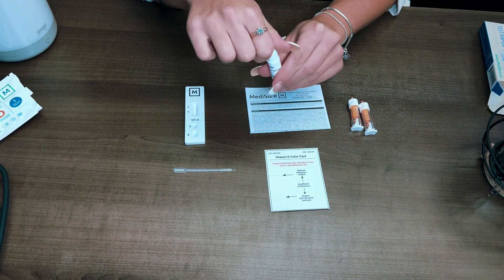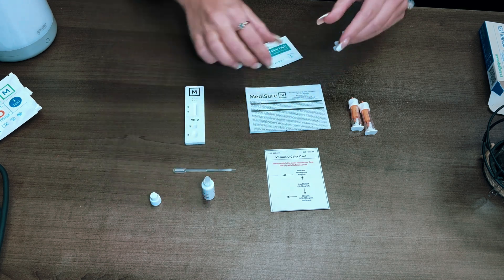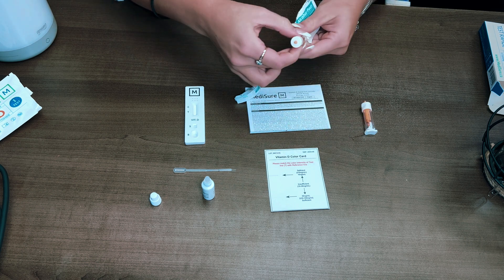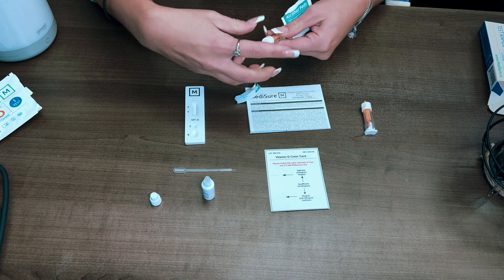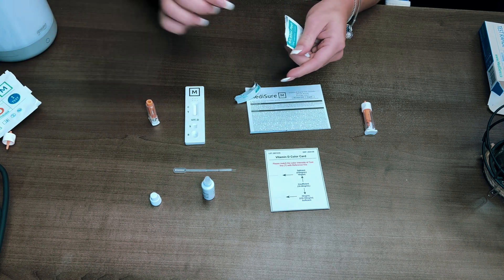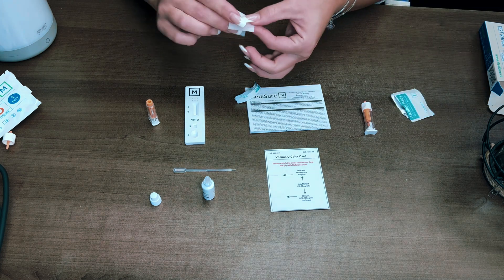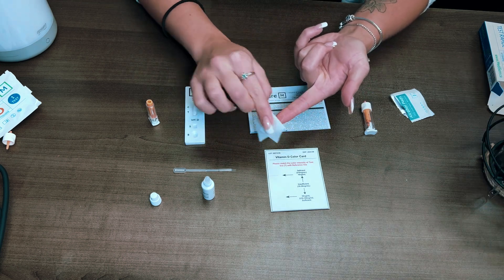This rapid Vitamin D test does not give you the actual number for your Vitamin D levels in your blood, but it does tell you if you're deficient, sufficient, or insufficient. Insufficient means you're on the low side and require some Vitamin D supplementation, whereas deficient means you're way below average and require a lot of supplementation.